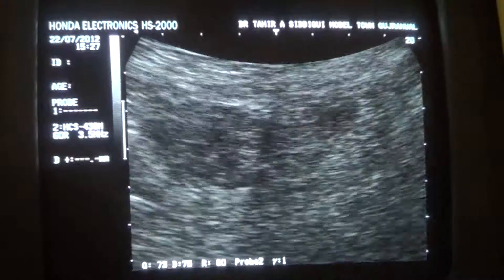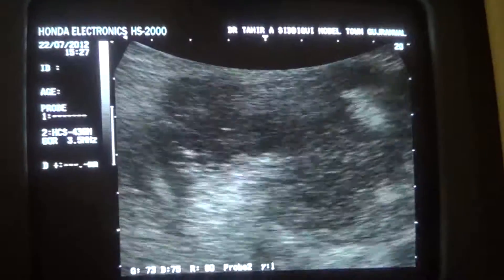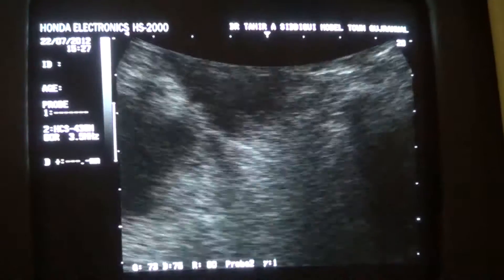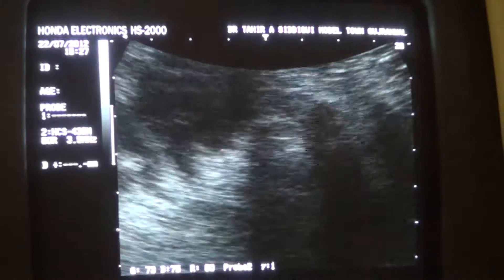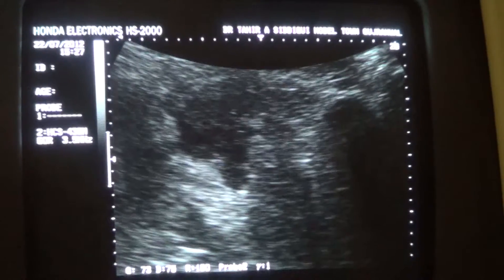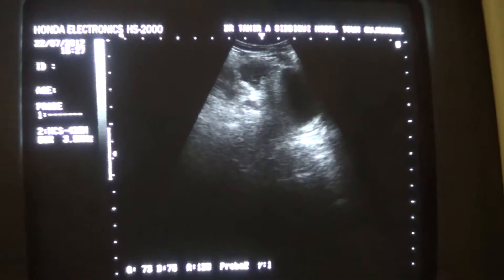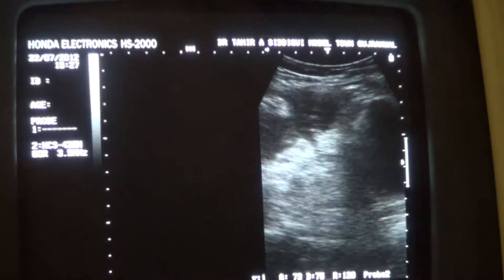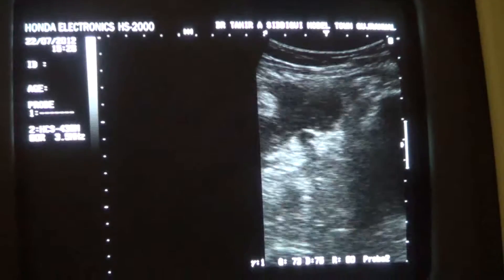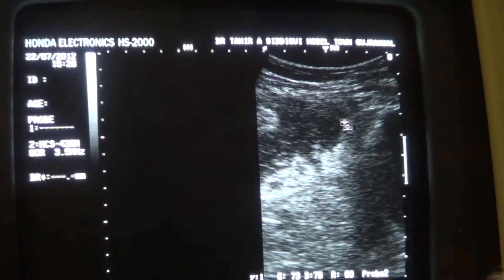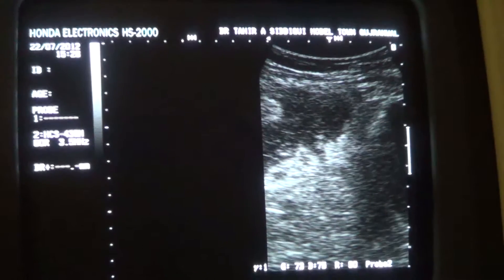I do not have any other lab investigations or clinical notes with me. Now this is the urinary bladder again. I am going to bring it to the normal view. Now you see this collection. This is the urinary bladder again with transverse section. This is the collection with trapped bowels.